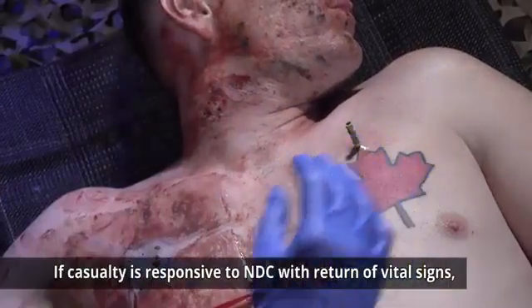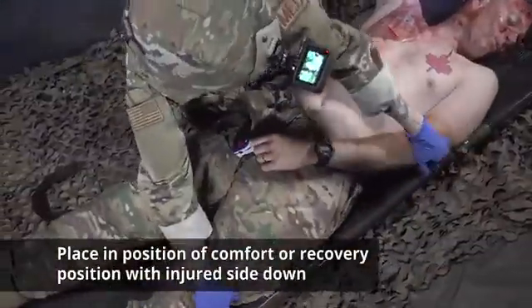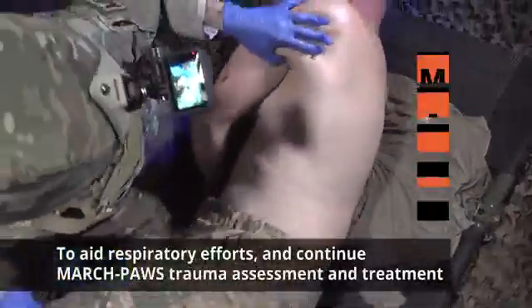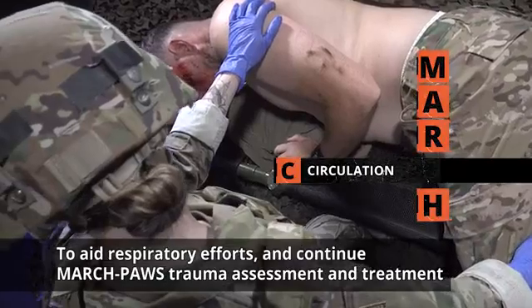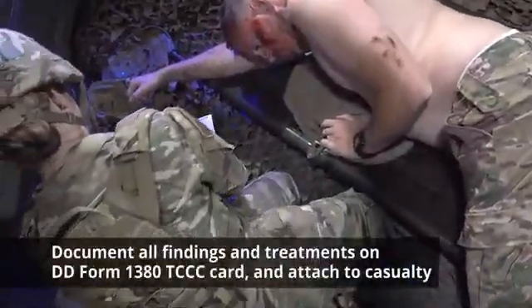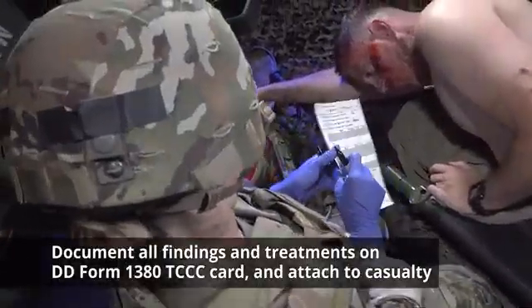If the casualty is responsive to NDC with return of vital signs, place them in a position of comfort or the recovery position with injured side down to aid in respiratory efforts, and continue the MARCH-PAWS trauma assessment and treatment. If bilateral NDC is not successful, consider discontinuing care. Document all findings and treatments on a DD Form 1380 TC3 Casualty Card and attach it to the casualty.